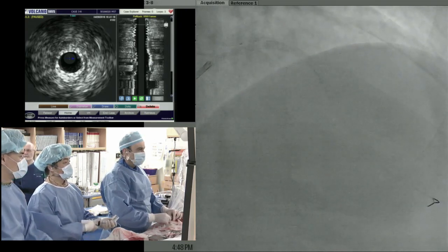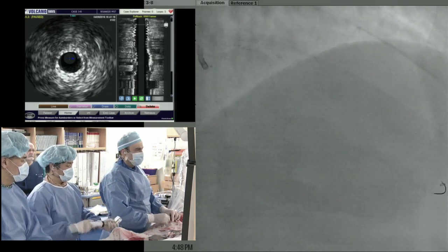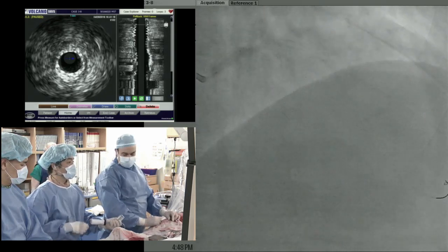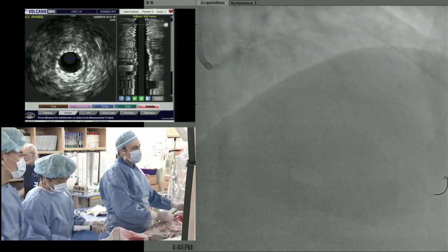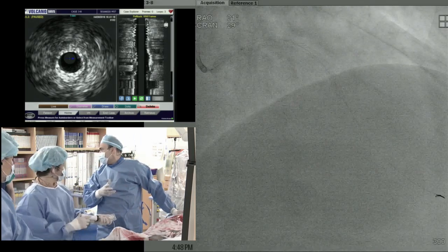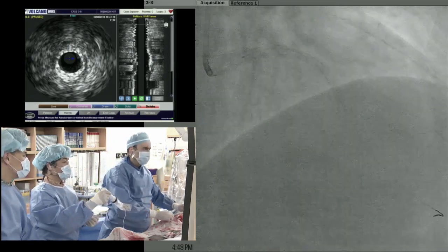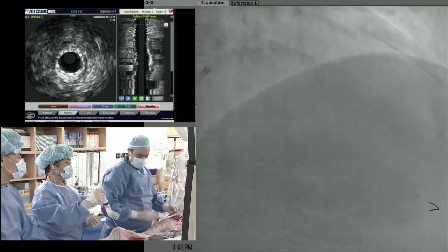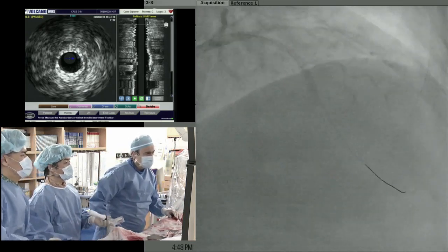Even in some disease of the circumflex? Yeah, right. We have done a series at several hospitals. We have done the jailed circumflex left main study and published in the Korean Circulation Journal. We're not going to re-IVUS, Gary. Even since it looks 80% already. I went 20 atmospheres with a 4.0. FFR negative. So we'll just test and make sure that everything is okay, free flow, and the dominant circumflex distally. I think it's better to leave it, not to injure the area.